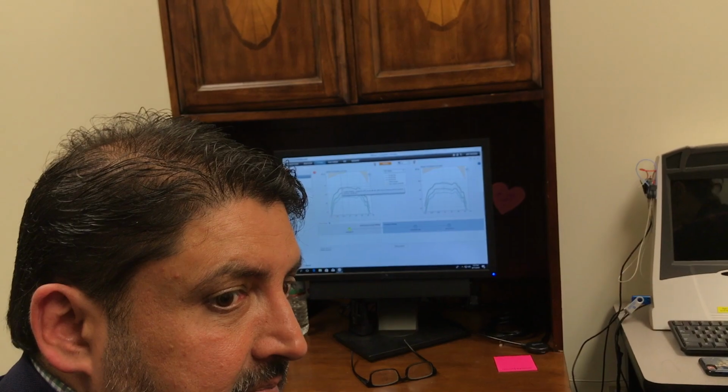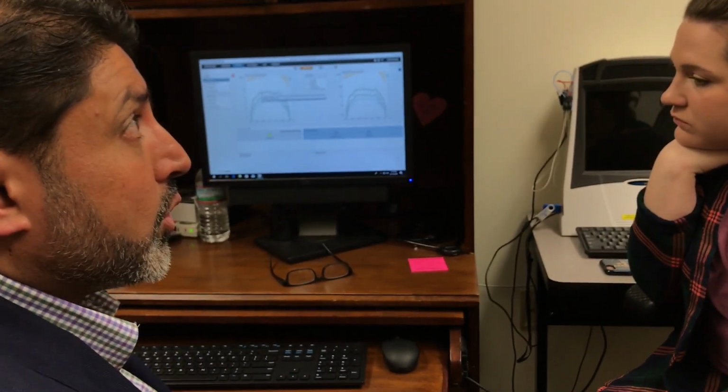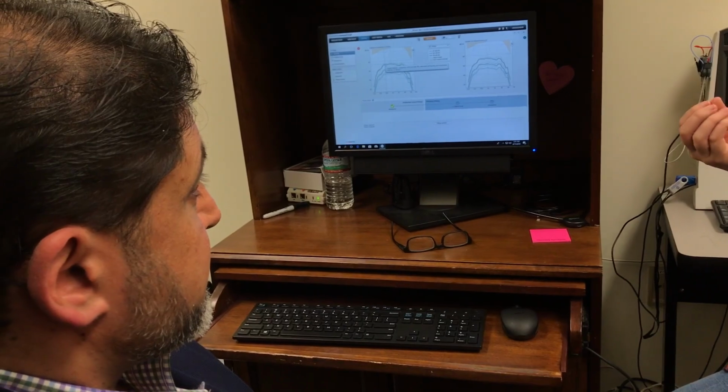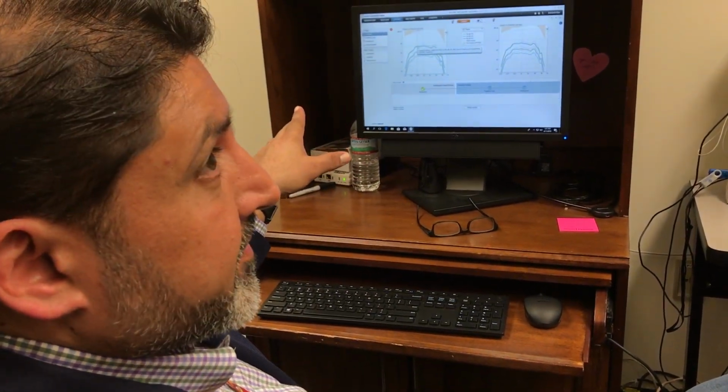Isn't that the same thing as real ear, like with the carrots, where it's trying to do soft, medium, and loud sounds? But why are we doing that? It is, but why are we doing it? Speech isn't at one intensity, like different sounds are gonna have different intensities. There's fixed frequencies? Because he could be in different environments.